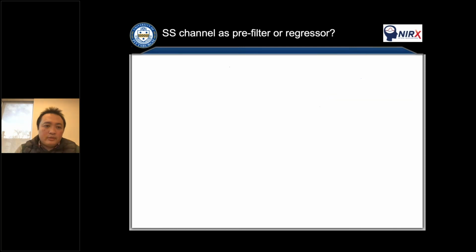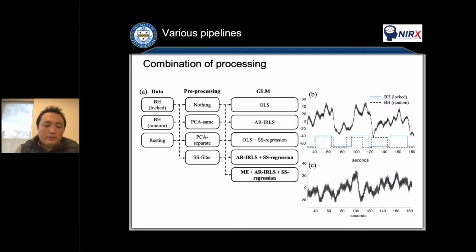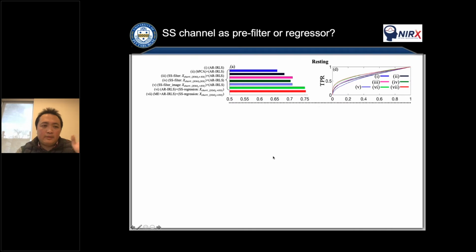So out of about 60 pipelines, actually we have more because of the many pre-processing options, let's say we have about 60 pipelines, and we only select 7 right now. This is the left figure. This is the area under the curve from the ROC. The ideal would be an AUC equal to 1, so a bigger AUC means better performance.